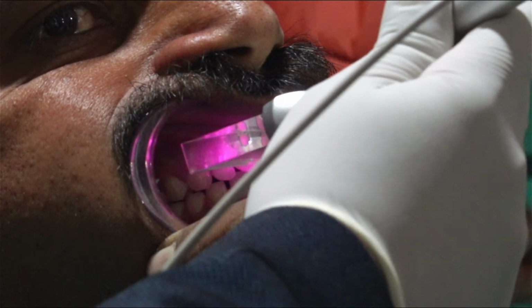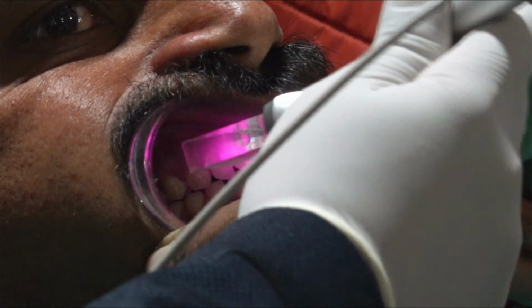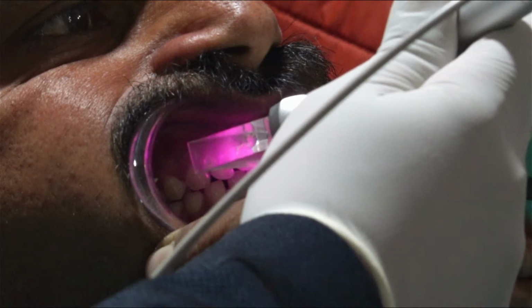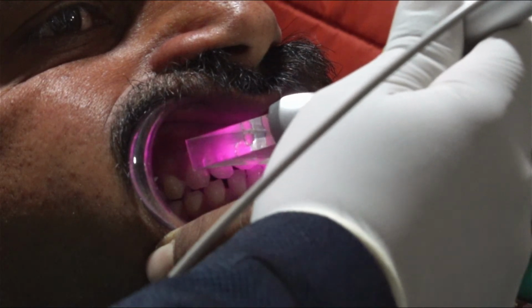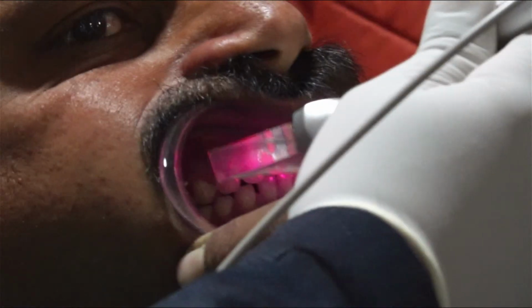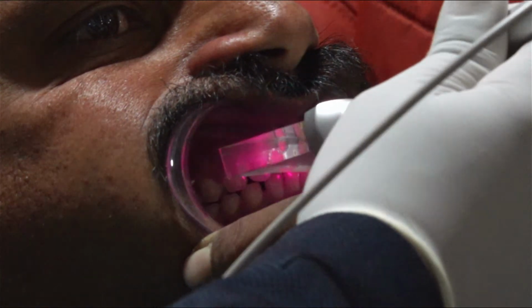So for this patient with not much of stains, 2 minutes is more than enough. Slightly higher, you have to go on increasing the duration, right? Maximum 4 minutes. But the whole prism length is 3.71.